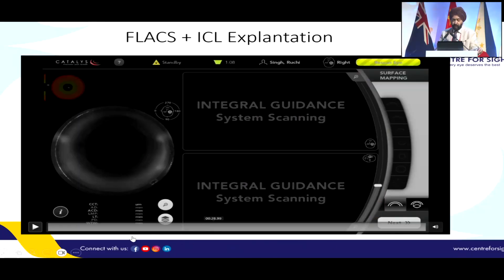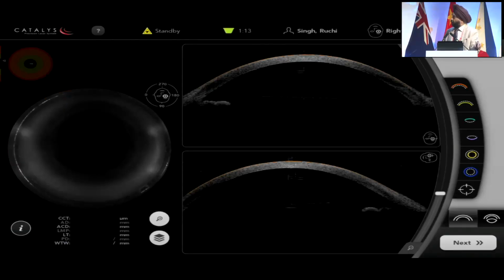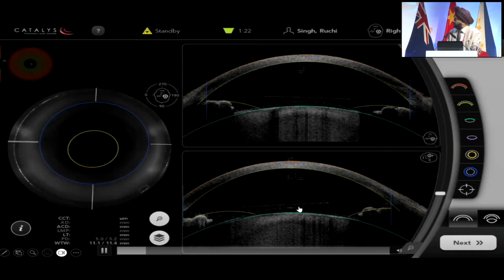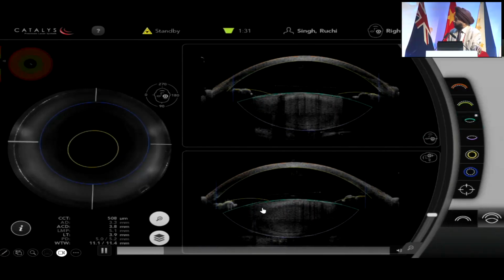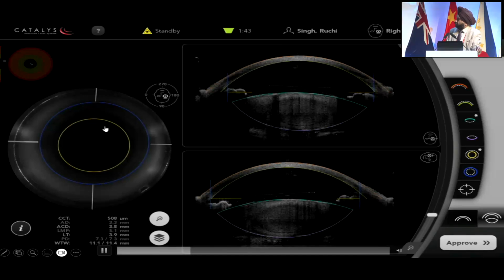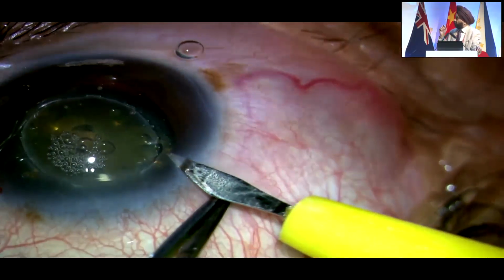If you have a patient with an ICL and developed a cataract, again, certain things in the complex cases, you can see here that this is the area where this is the lens, the ICL, but this can kind of mimic the anterior capsule, and you could see that the pupil was read as the optic of the ICL.